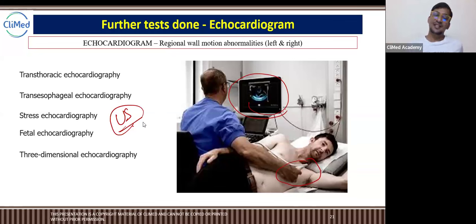Sonography, ultrasonography and ultrasound are the same system, but used for different purposes. It is like a customized version. The basic mechanism is ultrasound, but it is customized for different purposes, nothing else.